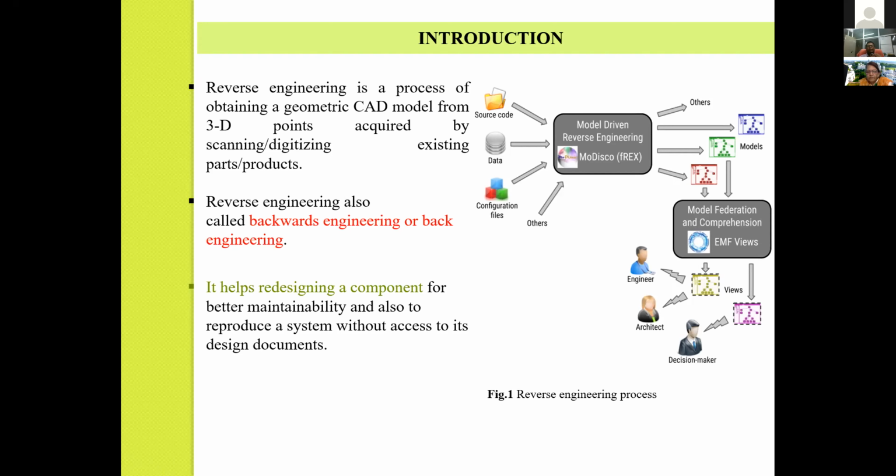So we take the data from those things. We have the geometrical information in a data form, which is a very soft form of data. We take this data and use it for our own purposes. So it is a kind of reverse engineering.